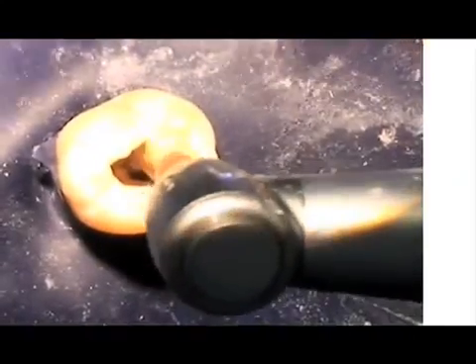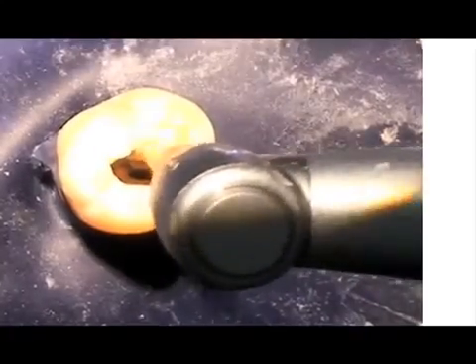To show you how the bidirectional spiral prevents the extrusion of cement over the apex, please note how the spinning spiral produces an ellipse of cement a few millimeters up from the tip of the instrument and drives it laterally against the walls of the canal rather than driving it apically into the periapical tissues. The cement action occurs when the cement is placed into the canals.